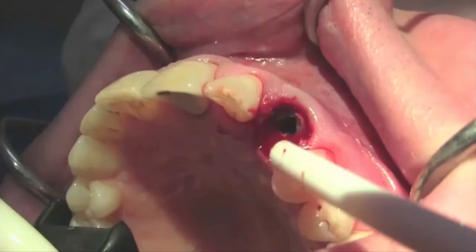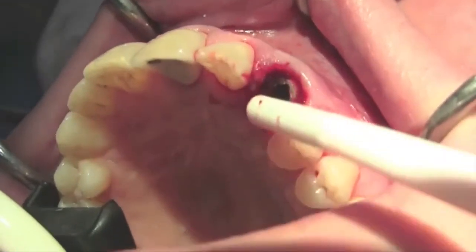These implants have a surface treated all the way to the top, so it's very important that we submerge the implant about a millimeter deeper into the bone than we usually do. We don't want to flush the cover screw with the bone. We want to be deeper, a millimeter or millimeter and a half, to facilitate the platform switch process.